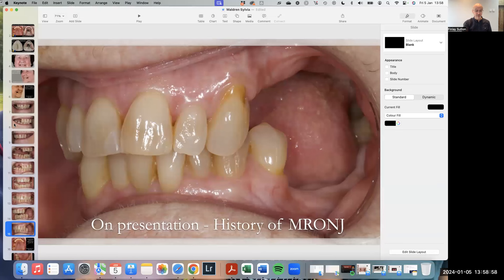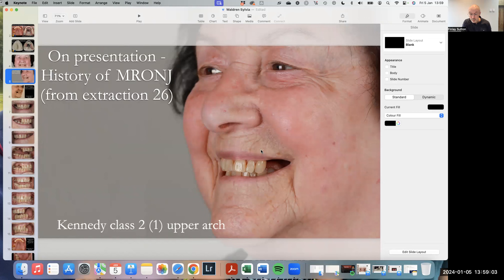It just means I want to see what's going to be on show. If we put a clasp on that tooth, is that going to be visible? How much space have I got — have I got space for putting the denture in here?